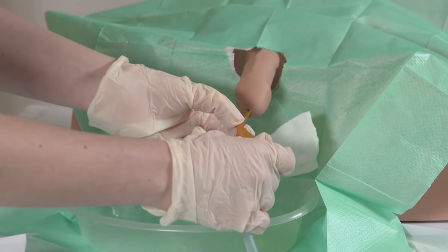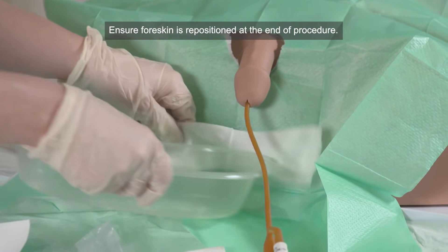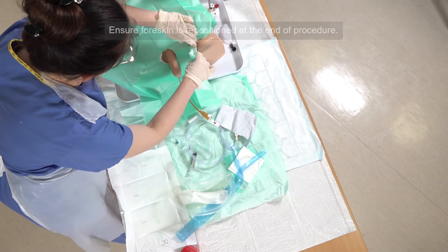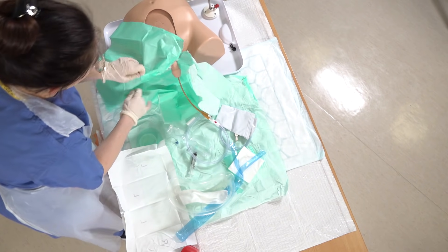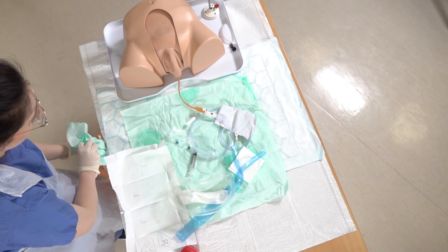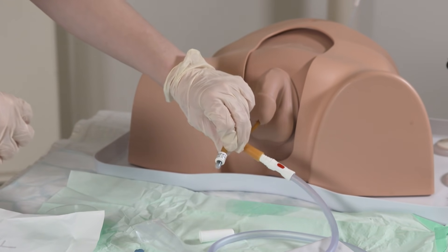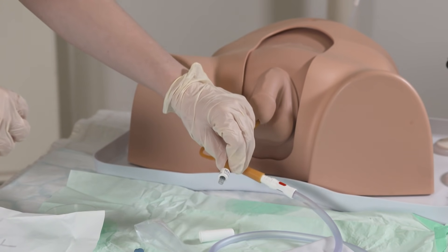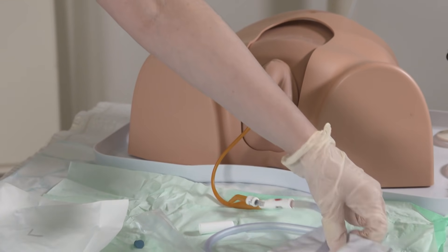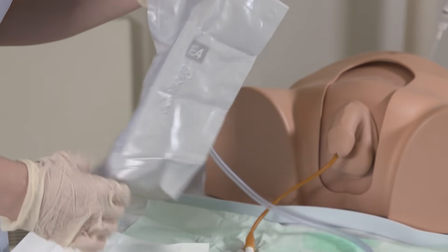Just withdraw until we have some resistance. Remove all of these things out of the way and remove the drape, and make sure to replace the foreskin at this point as well. Just a note on catheter size: I've inserted a 12 French, but we would normally use a 14 or 16 for a male. Then we can recover the patient, clean up our area, and record the residual volume in the catheter bag.